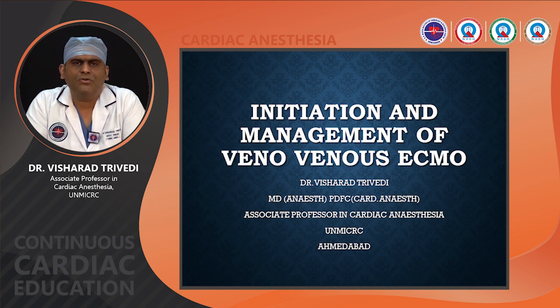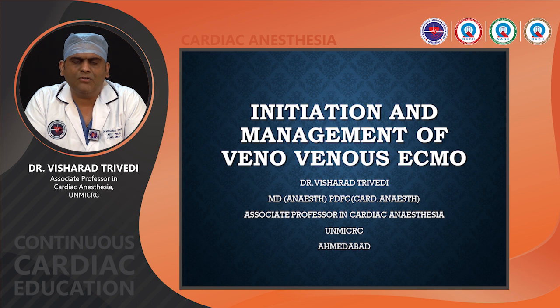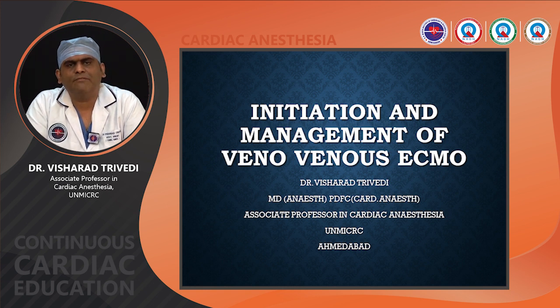As you know, there are mainly two types of ECMO, veno-arterial ECMO and veno-venous ECMO. In veno-arterial ECMO, you are taking blood from the venous system and giving the blood back on the arterial side, and in veno-venous ECMO you are taking the blood from the venous side and returning the blood back into the venous side as well.